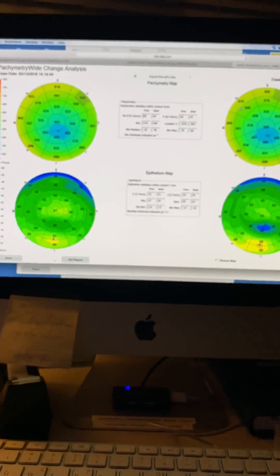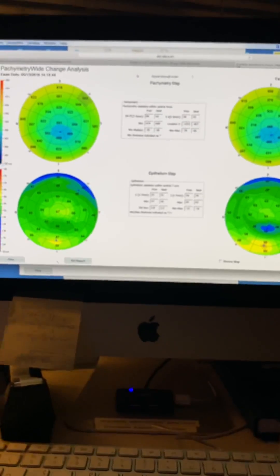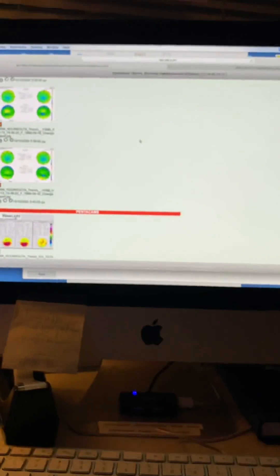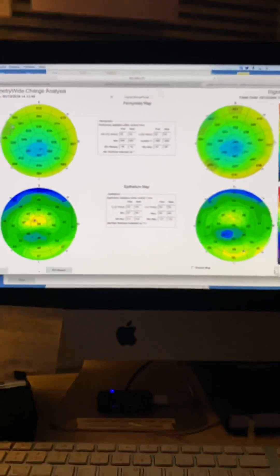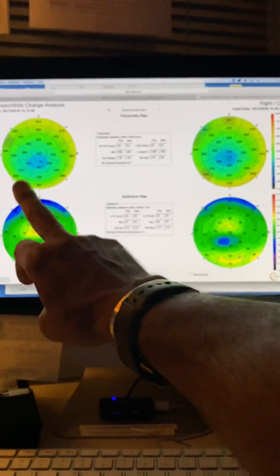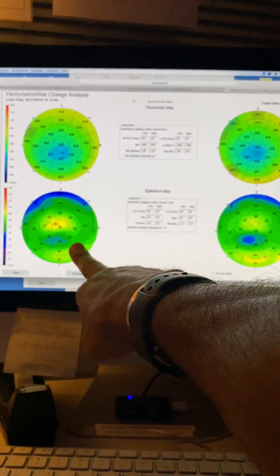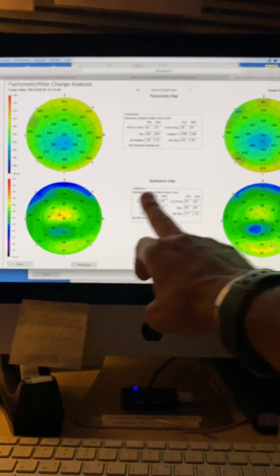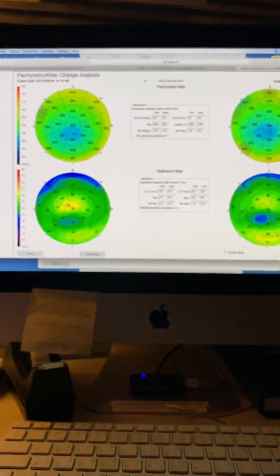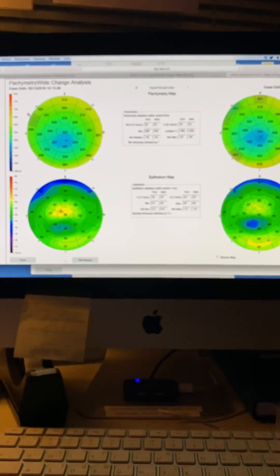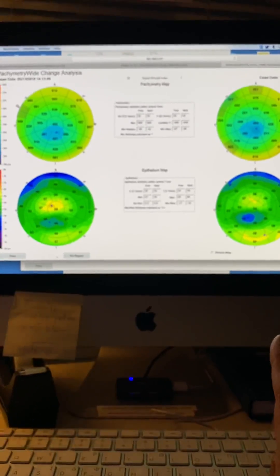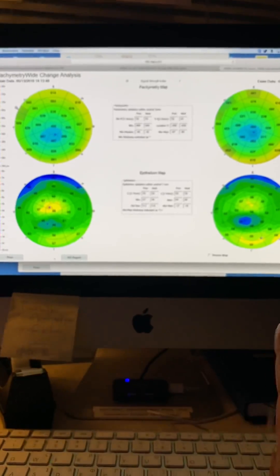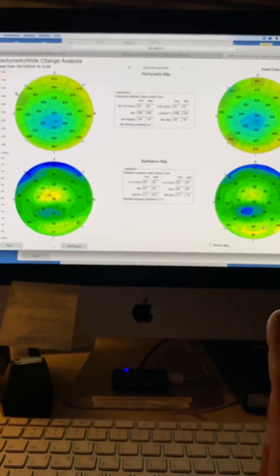The Scheimpflug tomographies are unable to detect these differences. And we'll look at the other eye as well. That also confirms worsening of the cone in both eyes. This is the now right eye imaged in September of 19. A year and a month later, keratoconus has definitely progressed. If we subtract the epithelial thickness from the total cornea thickness, she's lost 15 microns of cornea stroma.